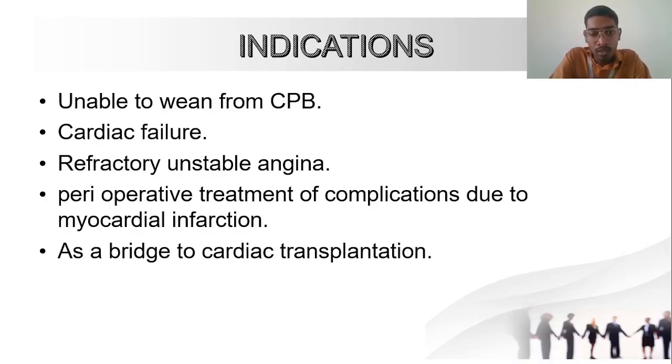If a catheter is placed there, damping and ventricularization occur. There is a flow there, A and B, as in Bernoulli's theorem. What we have to do is insert a catheter, so the pressure increases, and the patient suffers from a lack of oxygen supply as well as blood flow, where the patient may be at risk of cardiac arrest.